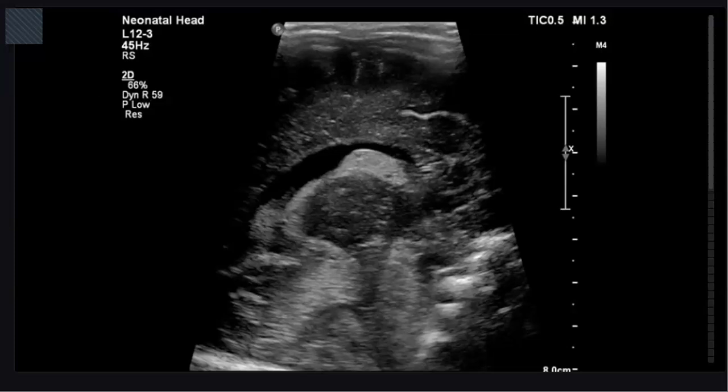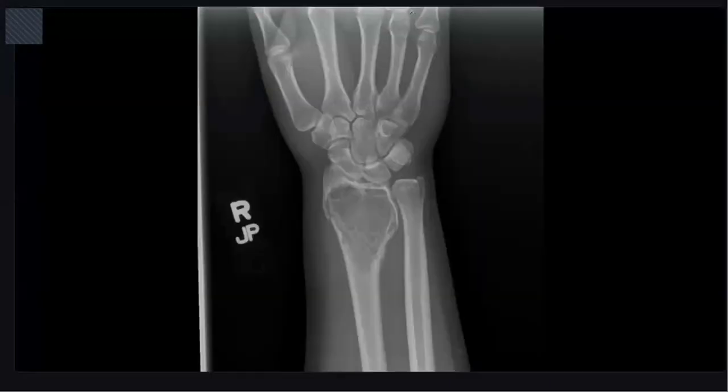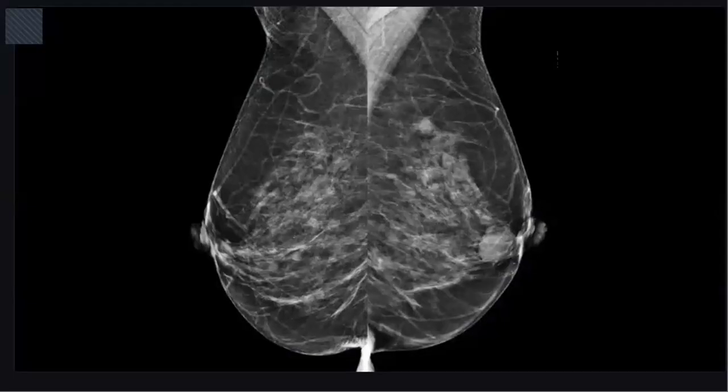Okay, Dr. Sameh, are you ready? Yes, sure. Okay, boss. I will give you the history for this patient. Consider it an adult female patient who comes for screening. Yes, shall I request the control? No problem. No many scrollable images, but you can ask.